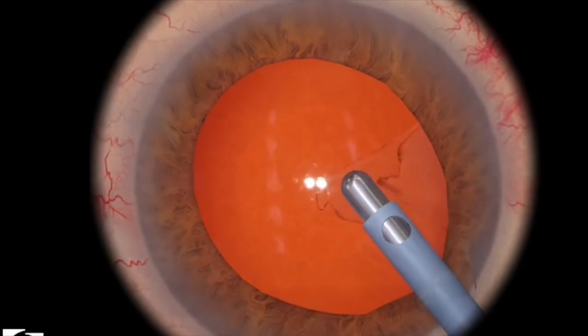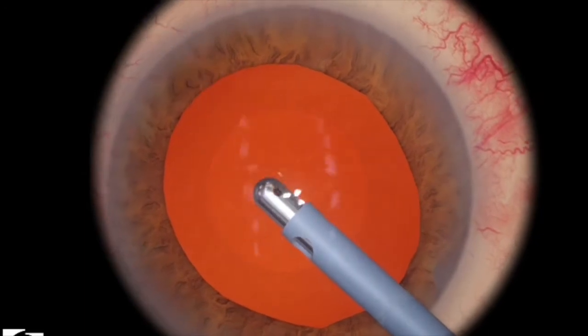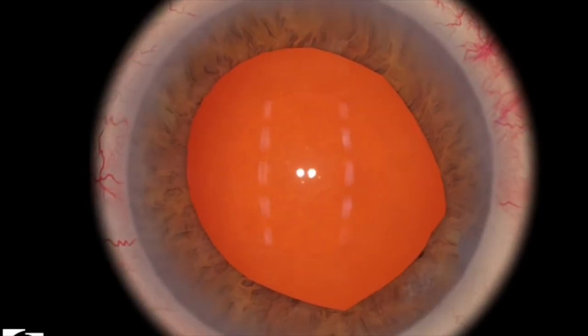Here one more time — I've engaged a piece, making sure I'm not engaging the capsule, and I'm pulling towards the center so that I'm away from the anterior capsule.